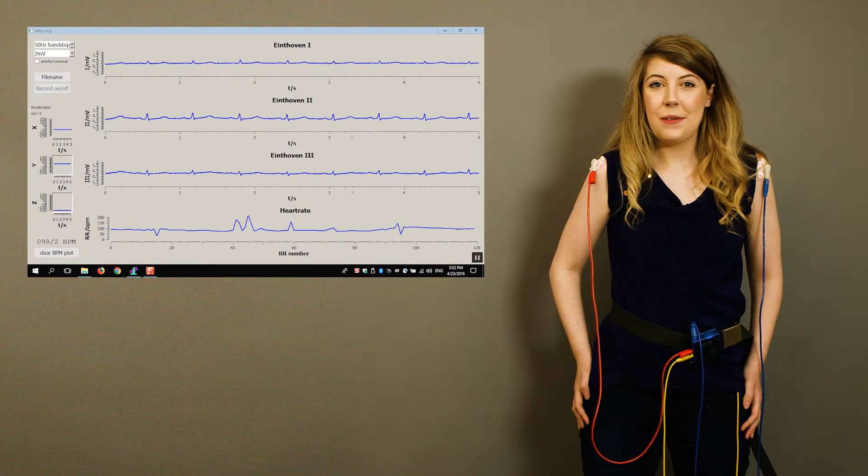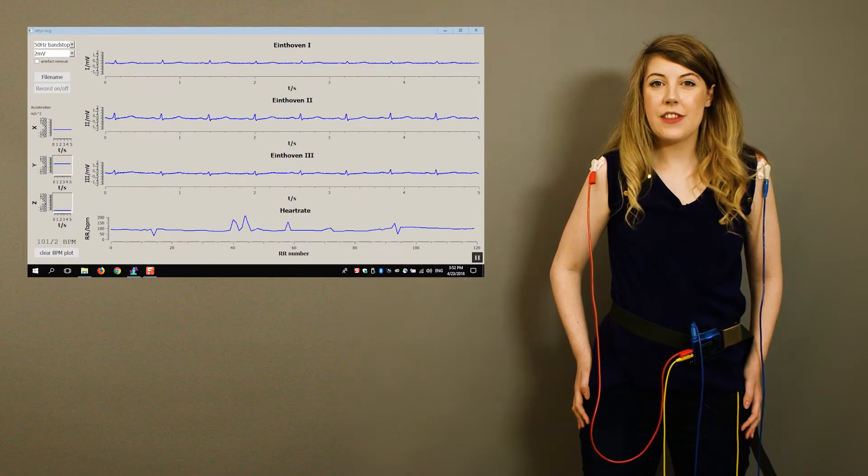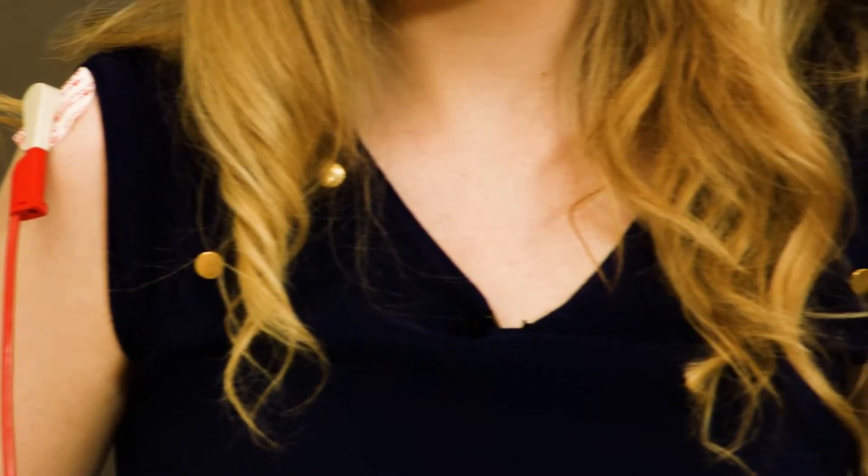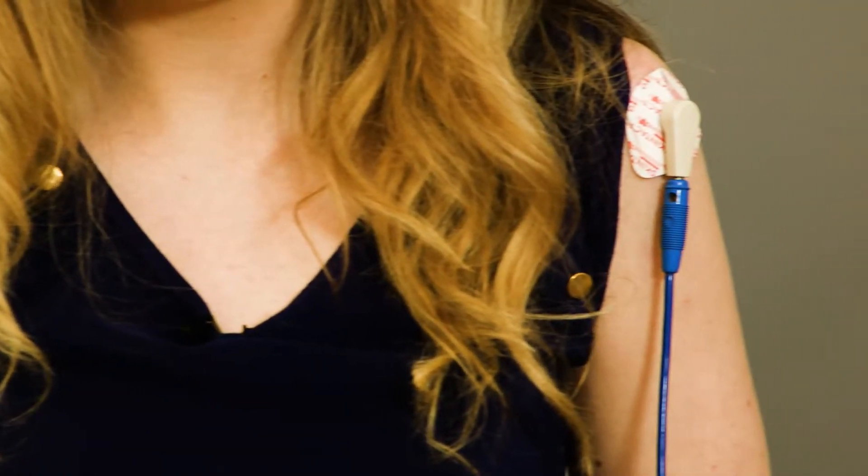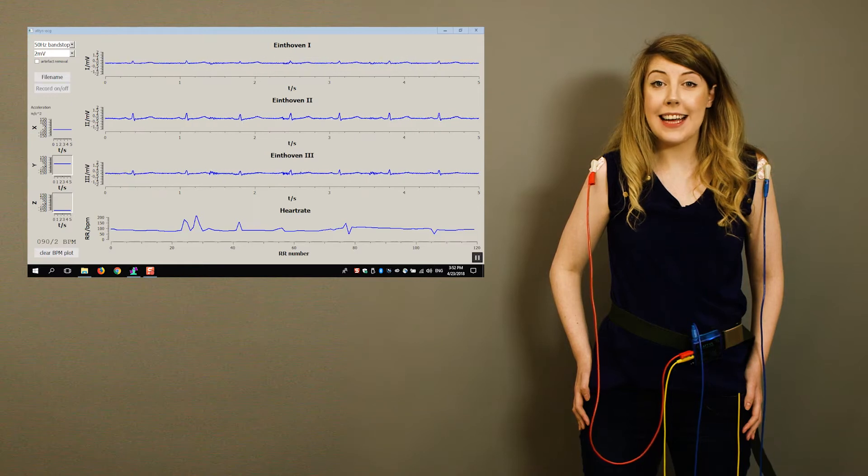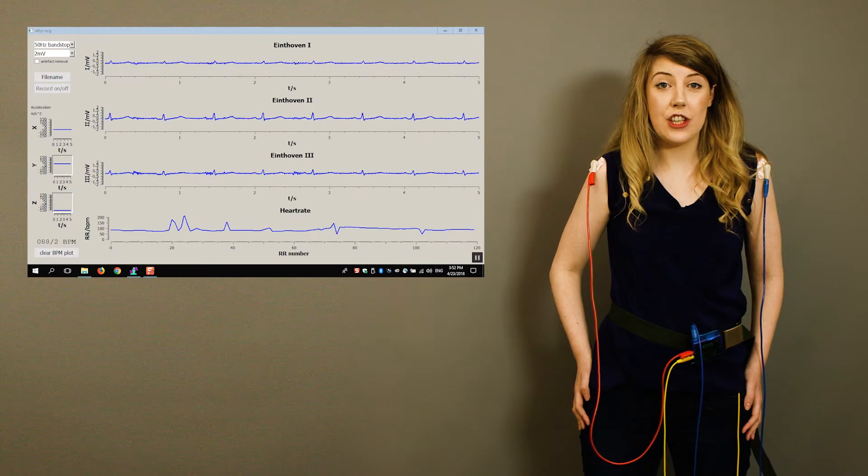Now, I have switched the electrodes much closer to the heart so that all the arm and leg EMG won't impact on the ECG.